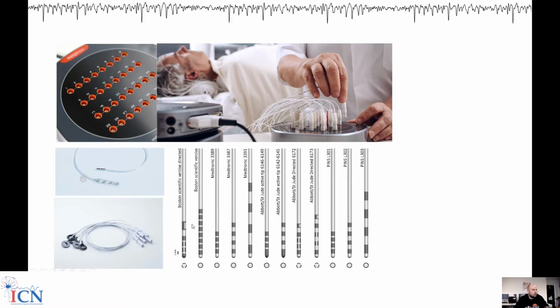Okay, so ultimately what we do is we connect, for example, some of these DBS electrodes, maybe an additional ECoG strip and some EEG electrodes to the input box of our electrophysiology processor. This is what we use, the current system. It is a TMSI Saga device where we would try to connect every single one of these contacts with an adapter to these inputs.